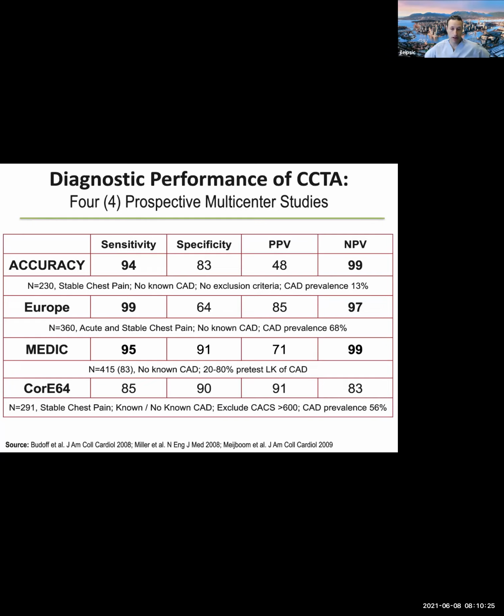In addition, when we look at the opportunity to not only exclude stenotic coronary disease, but exclude atherosclerosis, as we know, there's no real meaningful non-invasive test that can actually provide you a sense of the extent and severity and morphology of atherosclerosis, which we know is incredibly powerful in its prognostication and an ability to help guide personalized titration of medical therapy.